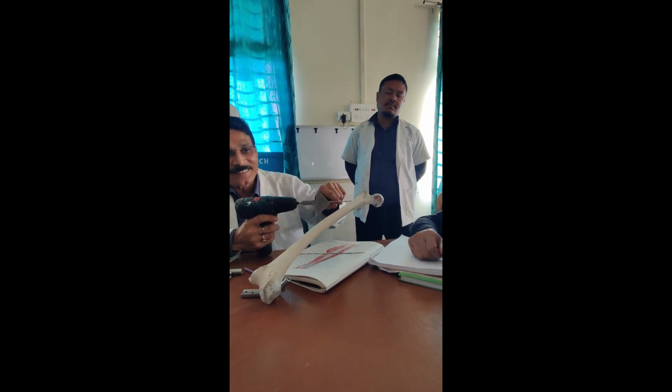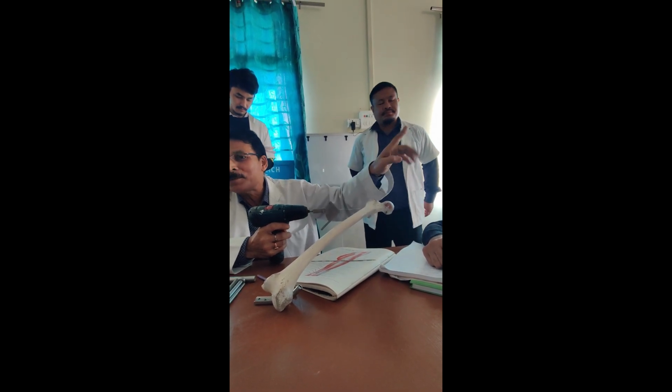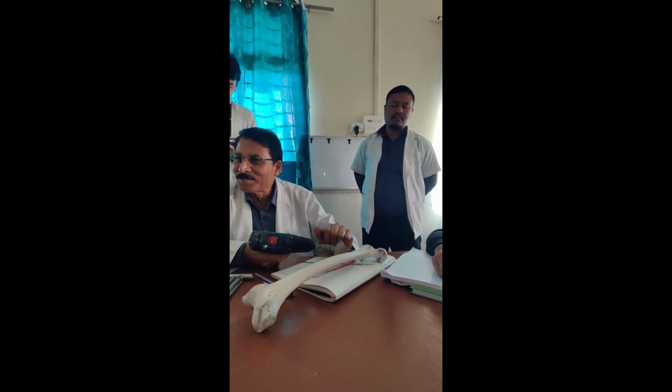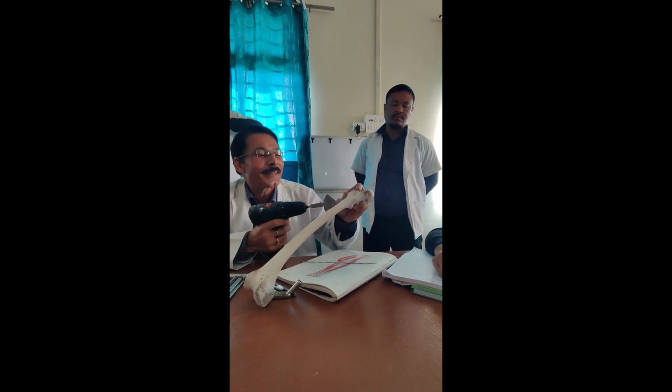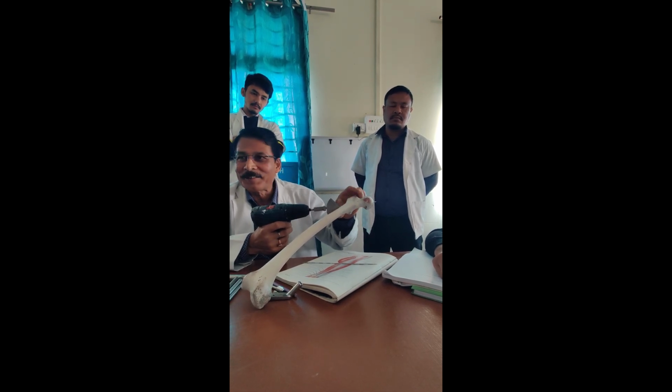In the lateral view, I can go posteriorly or I can go anteriorly, but my trajectory in the AP view is fixed. Okay, sir? That will minimize your radiation. So you put it now. It is said it will go up to the extent of the neck. Some people used to go up to the subchondral area also. Why is it so? So that it doesn't dislodge during the process of reaming and other steps. Clear? They are saying it is better to keep it a bit high up and lock it here so that it doesn't displace. That is another way.